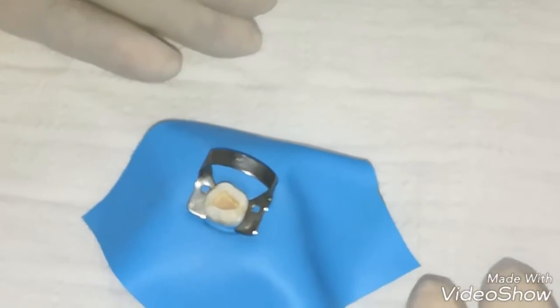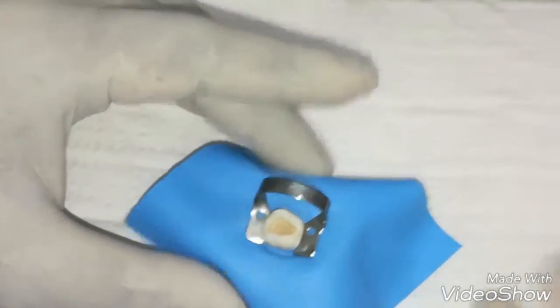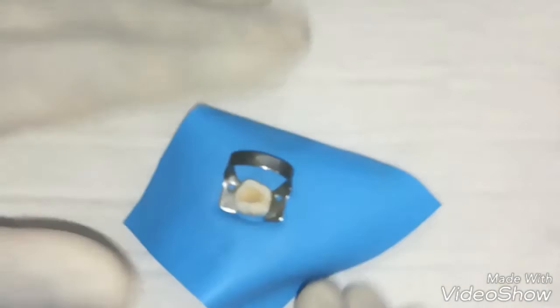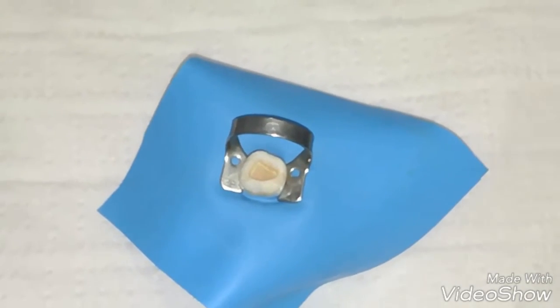First, prepare the cavity perfectly — there should be no residue of any kind. So firstly, we use the self-etching primer first.